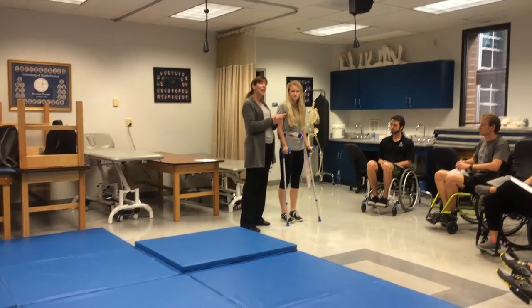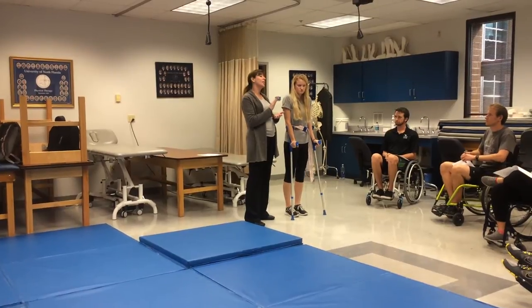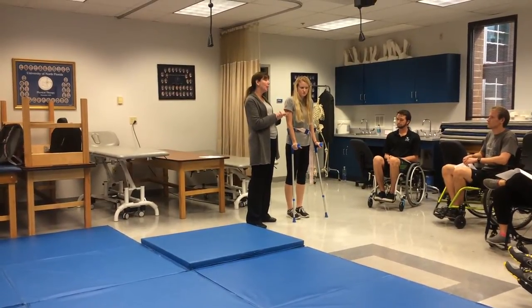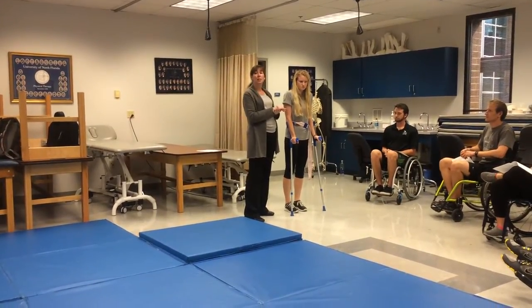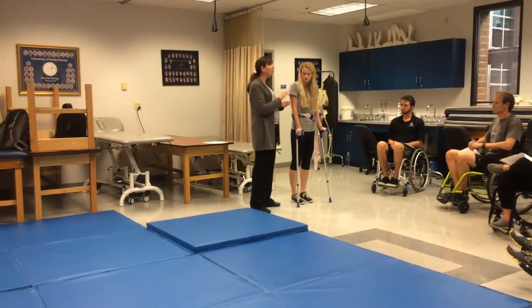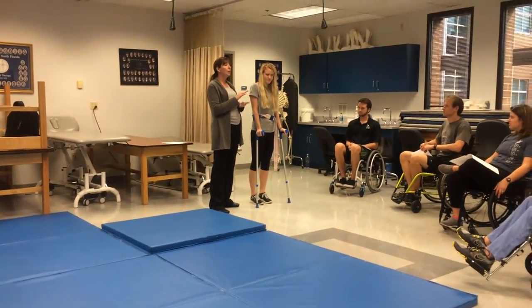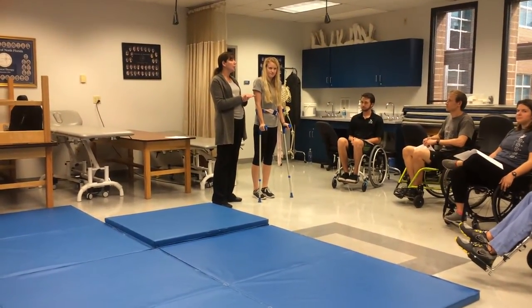T10. So what kind of gait pattern will she use? She has KAFOs and she's level T10. She's going to use a swing-to or a swing-through gait. We would start at the parallel bars, then we would progress to forearm crutches.